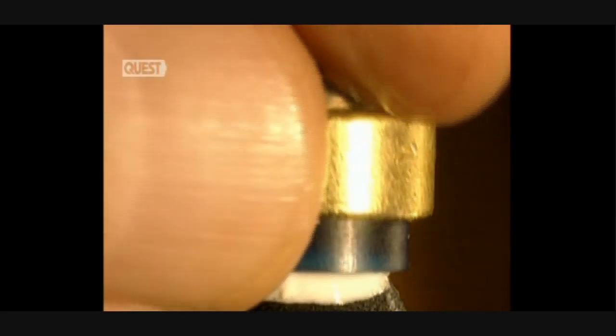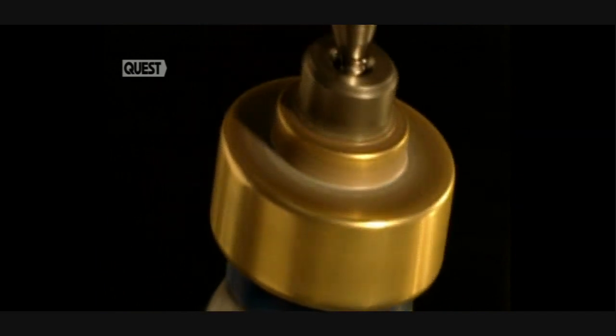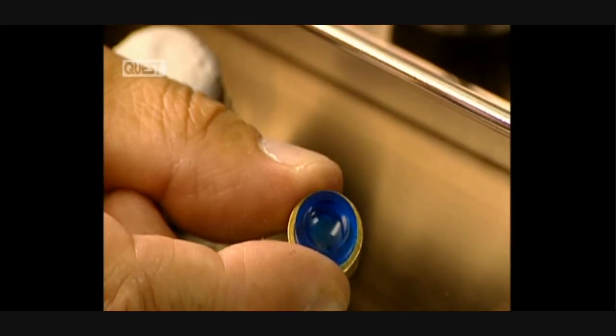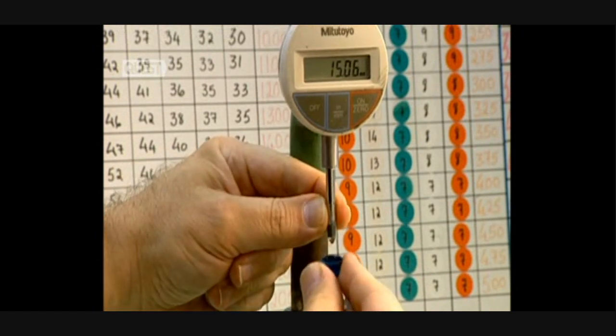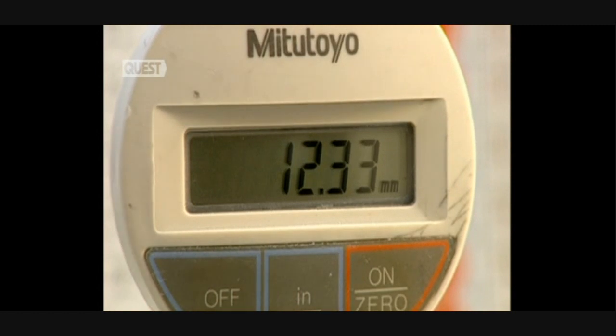The disc must be free from any imperfection and is polished with a super fine abrasive paste. Polishing is an essential step because it guarantees excellent comfort and perfect vision. A technician then measures lens thickness with an extremely precise gauge.